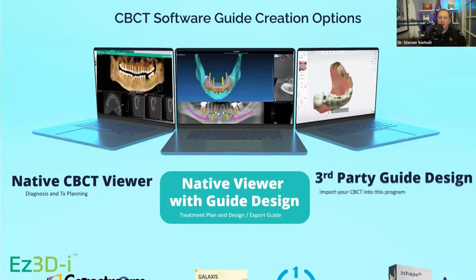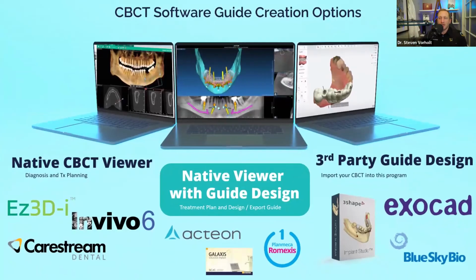And so if you have one of the machines on the left, you're going to need one of the softwares on the far right in order to do both things. If you are in the middle here, where the Acteon and Sirona and Planmeca kind of live, they're kind of an all-in-one package. It's inclusive if you want to pay for the upgrades in those software and unlock those options.